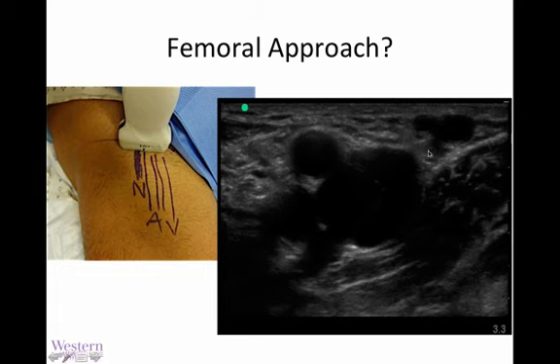Now, the vein, as seen here medial to the artery, which looks like it's bifurcated here, is easily struck. The interesting thing is the saphenous vein up there is commonly hit during a blind approach, and explains many of the times that you're unable to thread your guide wire or to get your cordis in.